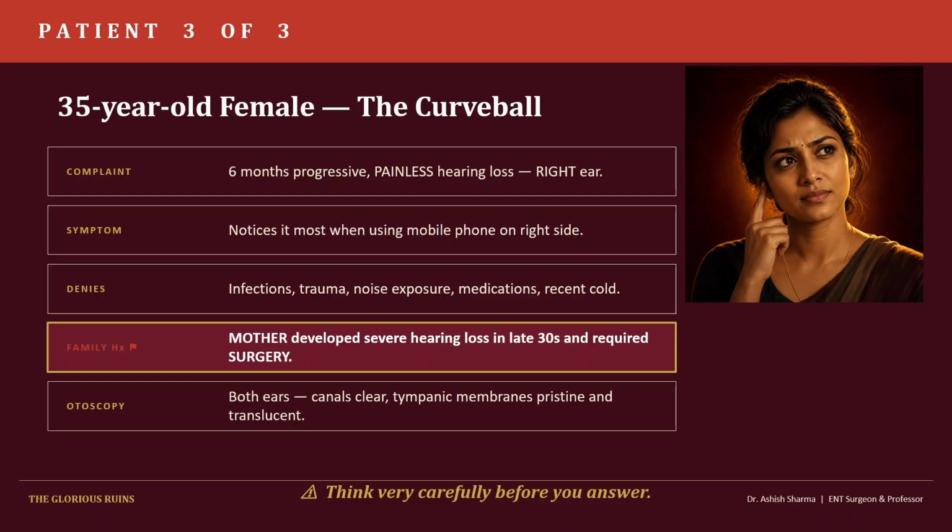Standard thinking, either right conductive blockage or left sensory neural problem. But clean otoscopic examination makes a conductive blockage seem very unlikely. Let me check Rinne to clarify. So right Rinne test, fork on the right mastoid, she signals, I swing to the ear canal, she says, yes, I can still hear it humming in the air.